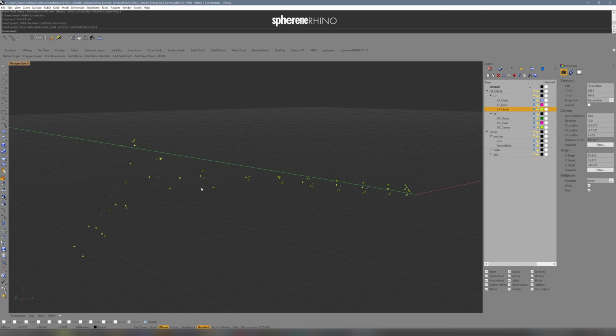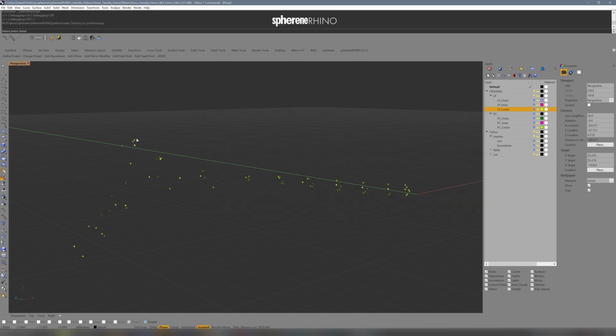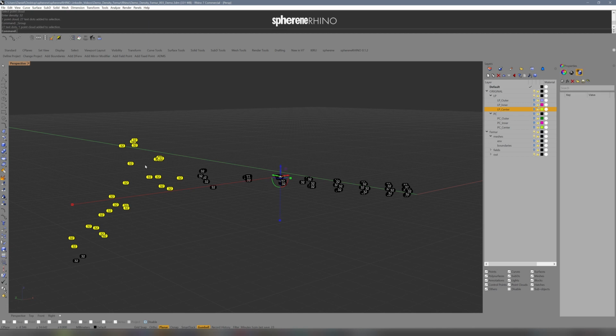I could now by hand place a density field point at each of these points, but I can use Rhino scripting for that. Select the point cloud, then I can enter a density, let's say 32, and it will place a density point at each of these points. I made groups out of them, Alt G, generate the group. This allowed me to have the whole group selected at once and enter the density values for all of these points at once. That makes it really fast.